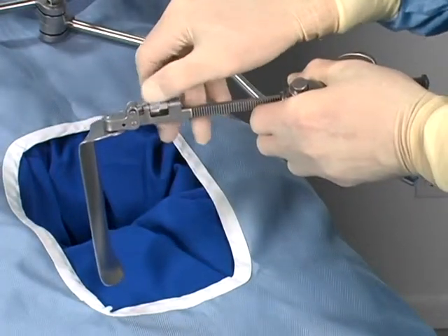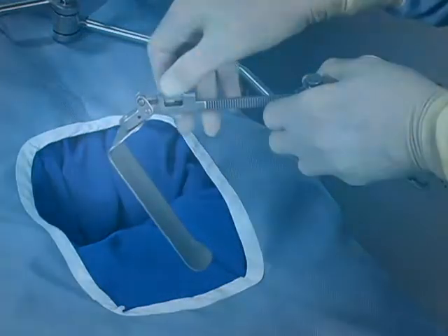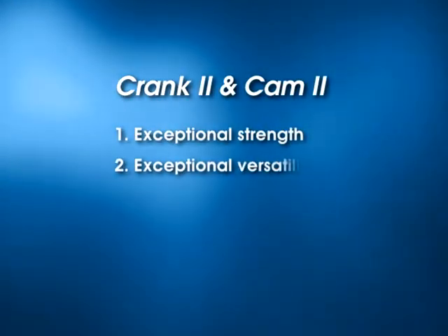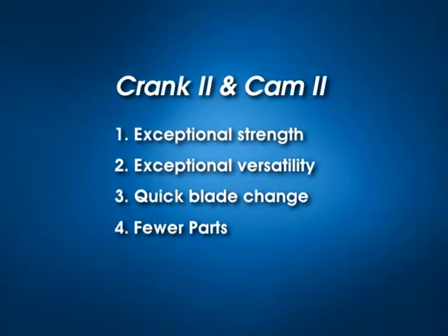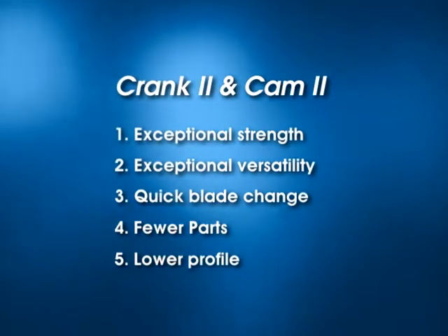Angling handles are also available with the Crank 2 handles for even greater versatility. The Crank 2 and Cam 2 clip-on joints provide exceptional strength, exceptional versatility, quick blade change, fewer parts, therefore simpler instrument counts, and lower profile for easy access to the incision.